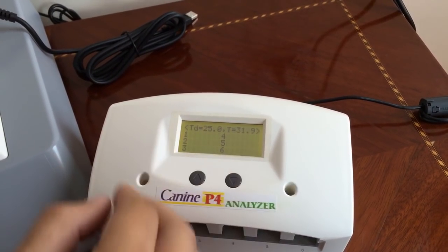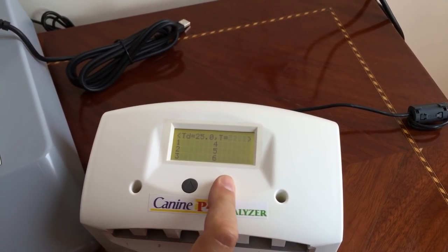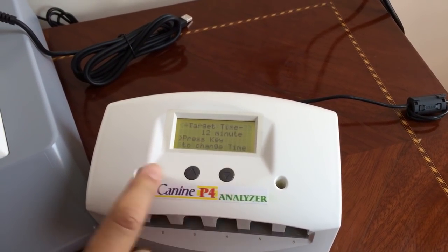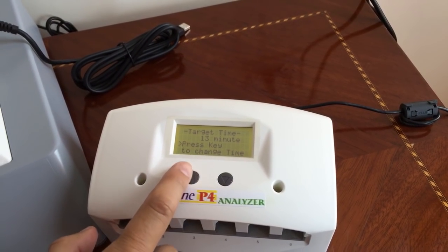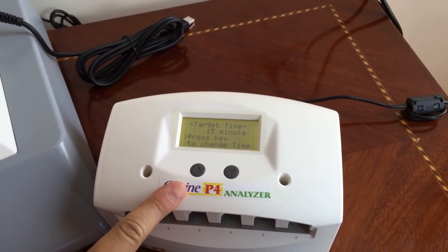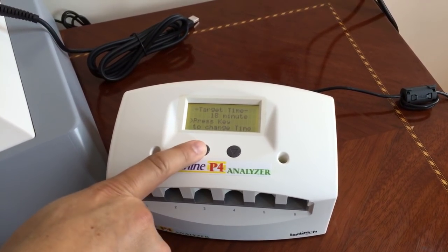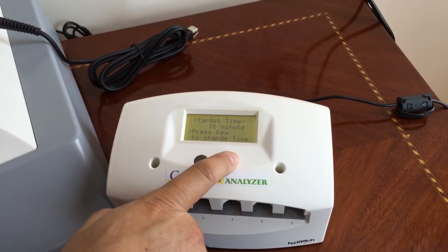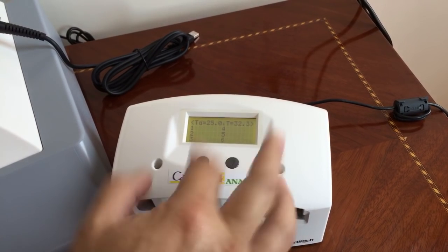We press both buttons and it brings you back to the original settings. If you press this button on the right for five seconds, it's going to take you to the time menu. For progesterone, we need 15 minutes before ovulation; after ovulation it's 20 minutes. So let's leave it at 15 minutes, then press both buttons again to go back to the main menu.